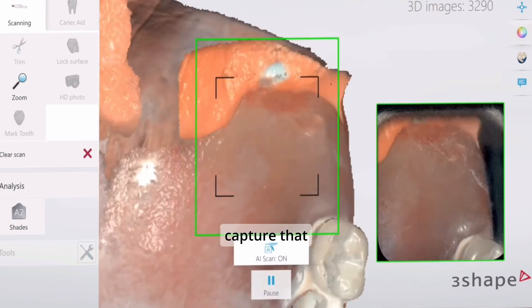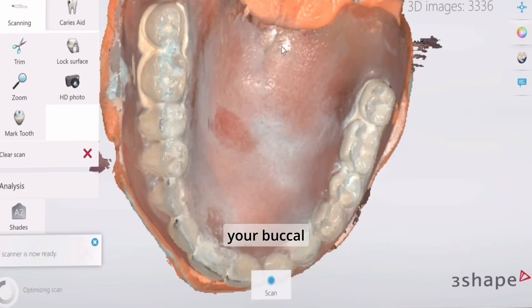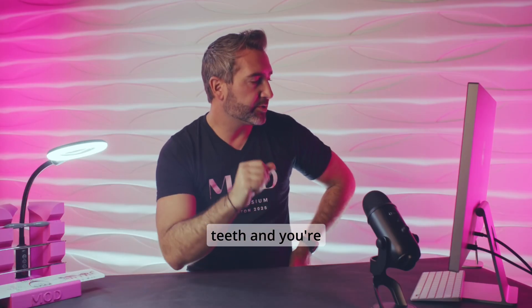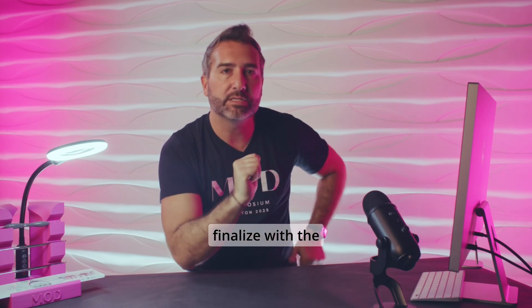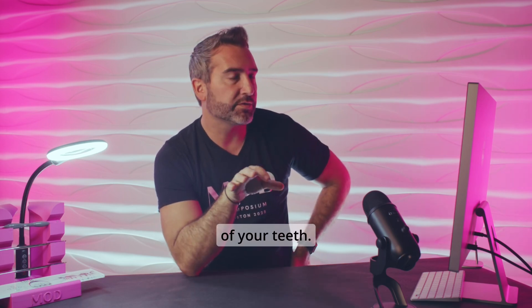Once you capture that, you're going to go ahead and get your buccal flange and your teeth, and you're going to combine all that information and finalize with the occlusal surfaces of your teeth.